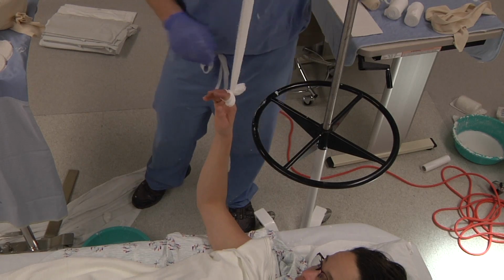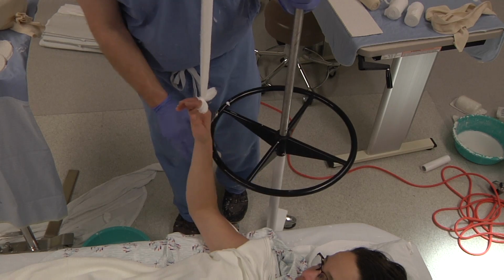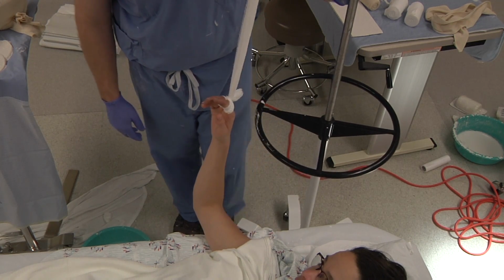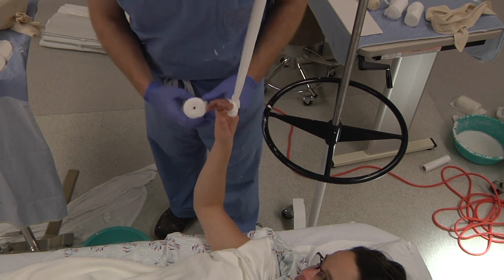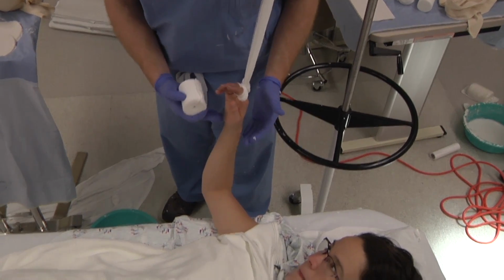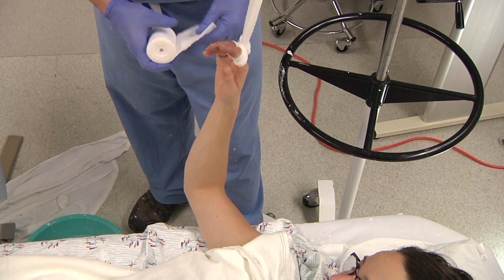If you are using an IV pole, most commonly they do have these rings on them. Just be careful that's not for an extended period of time pushing into the patient, as that can cause some skin irritation damage. From here, you can check easily with C-arm, making sure if there's any fracture reduction that needs to occur. That's easily done at this point.